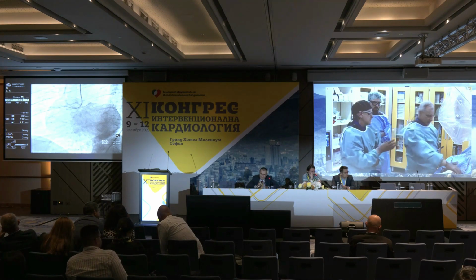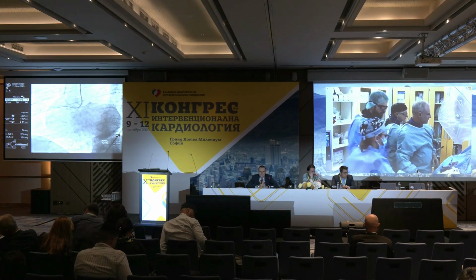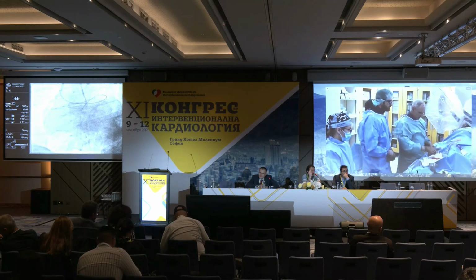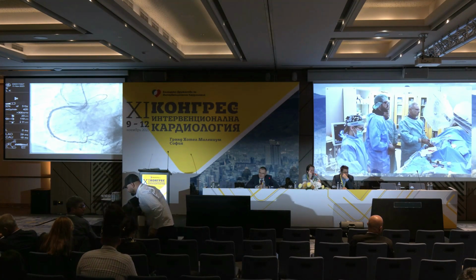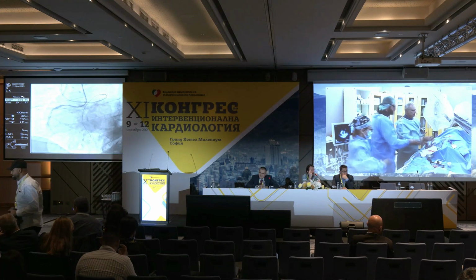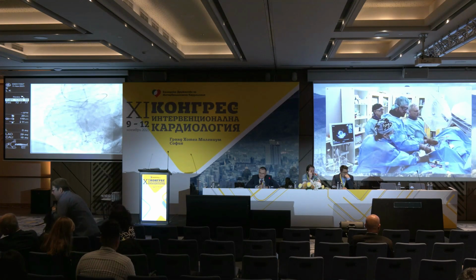Maybe when we remove the gear, let's remove the left system and the gear, and we can always have good access there. Let's show how we will do that. We can put the antegrade guide wire. It is stable there. It's LS2 actually, I think. Give me again the run through. So let's focus a little bit.